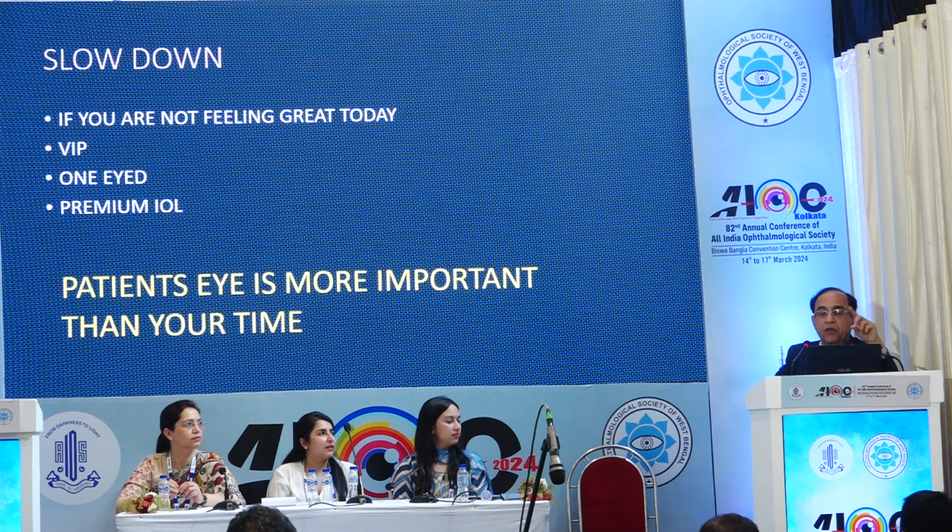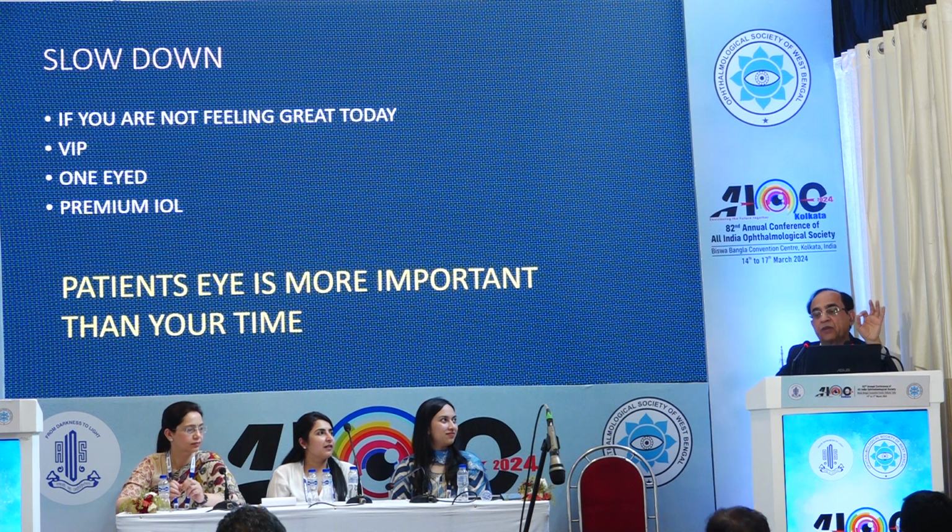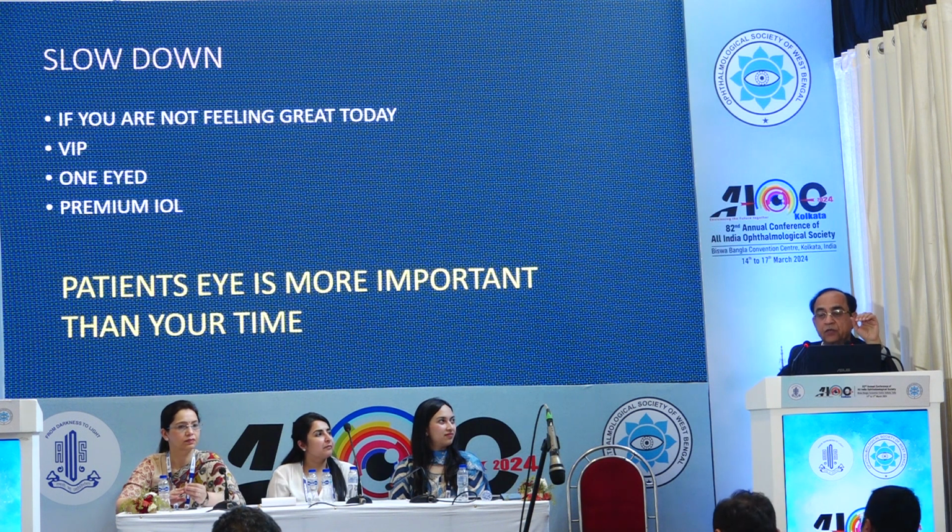But next day when I see, the corneas are not clear. When I say, oh, I'm relaxed, I'm in no hurry, the list is small, even the hardest of cataracts will have no corneal edema. So slow down if need be. The patient's eye is much more important than your time. Thank you.